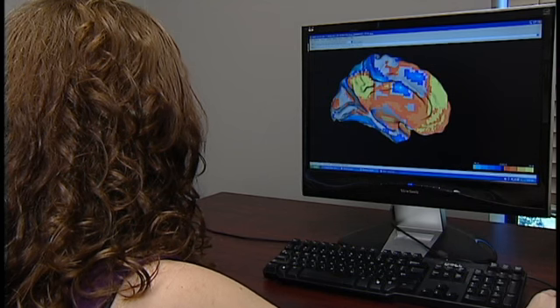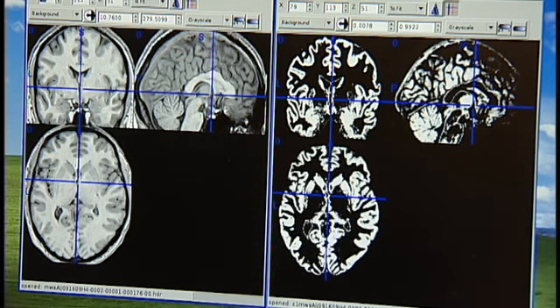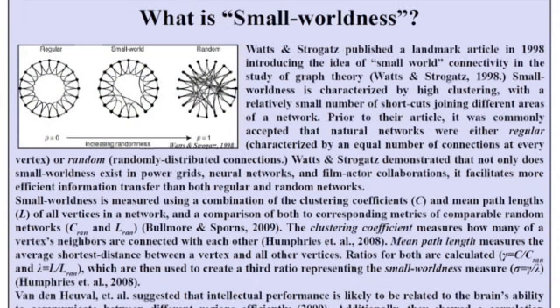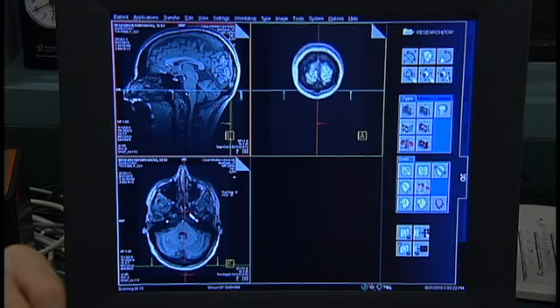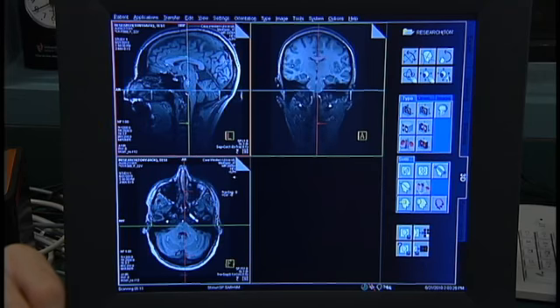In addition to looking at how functional data relates to task performance, we are also using a technique called voxel-based morphometry to examine how differences in gray and white matter volume relate to individual ability in different domains. The functional data we have collected also affords more mathematically complex analyses, which are based on advanced mathematical methods that are currently under development to characterize patterns of connectivity as well as the complexity of activity within a region. This illustrates some of the principal points involved in a large and complex study, from data collection through analysis.